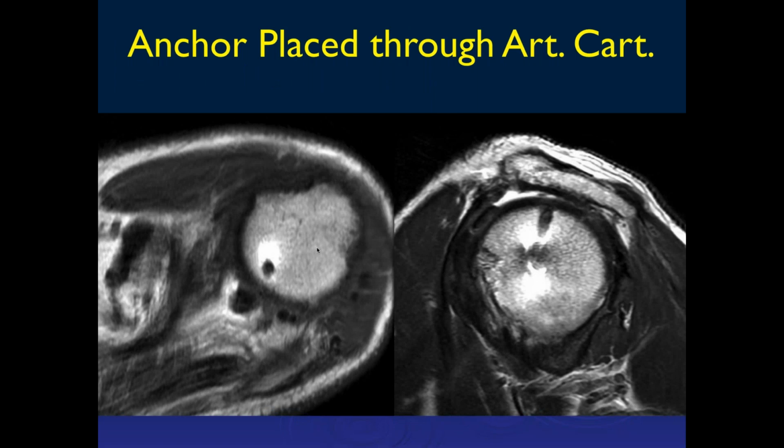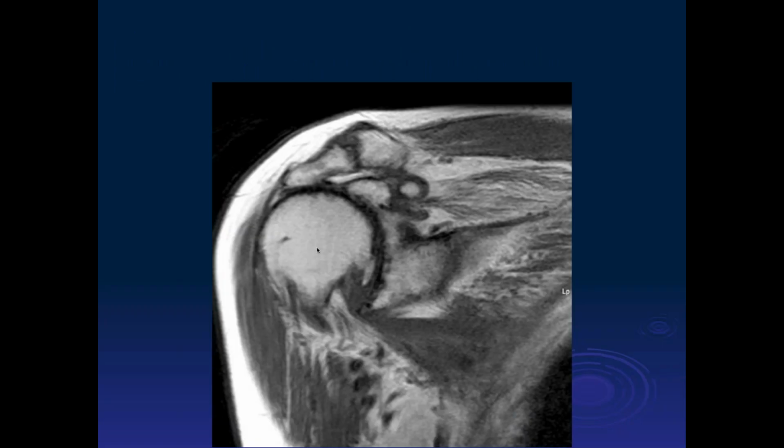All right. It's like First World War. Okay. And then here we can see this is... Ditch it. John, what did you say? Just like the First World War, those ditches they used to make. Right. Trench warfare. So trench, right. You practice trench warfare in the operating room. That's a good example for the surgery that I would do. You make a trench and then you pull the tendon into it. I never had a problem with that.